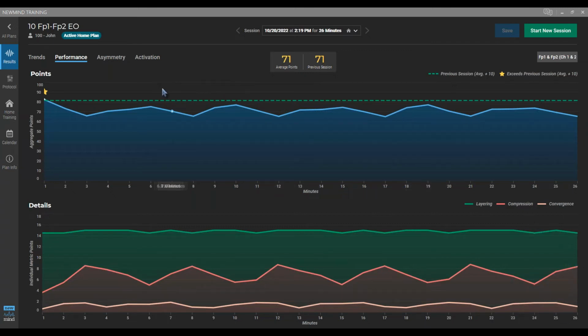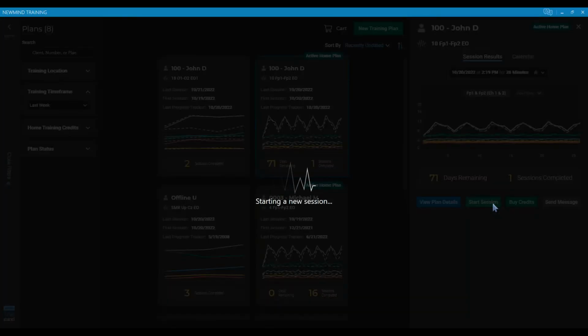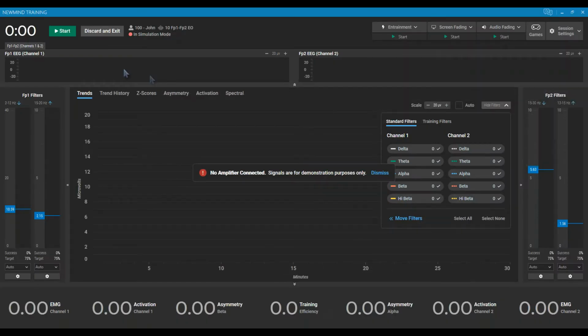This is Hilda Jameson. I just wanted to add something to what you just said. I've also seen the convergence really way off with kids that have developmental issues. We're not talking about just one component band that's really off, like alpha, but the whole spectrum, the whole EEG. So I'm wondering, what can you do to help that? It would be great to be able to see that on the convergence, but in addition, what can we do to actually fix it?